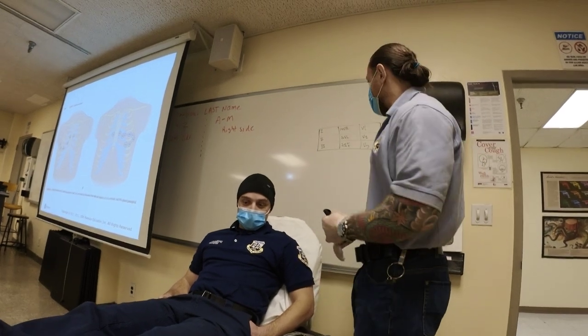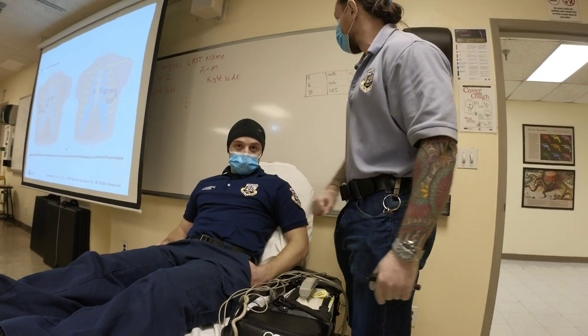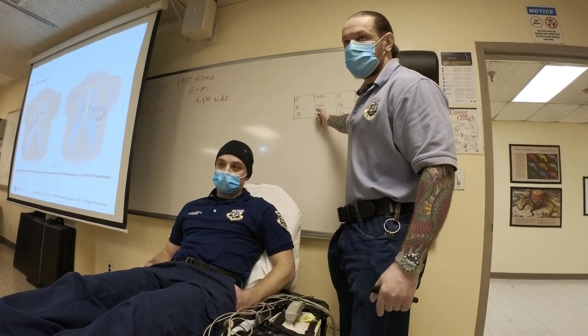But the moment I do a 12 lead, if I leave those limb leads on his torso, it's going to over amplify because they're augmented voltage. So you have a non-diagnostic 12 lead if you leave the limb leads on the torso. So it becomes no longer diagnostic.